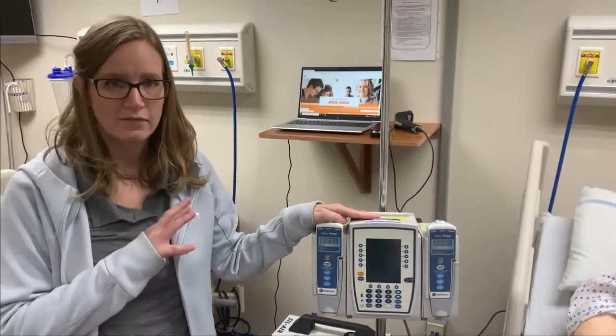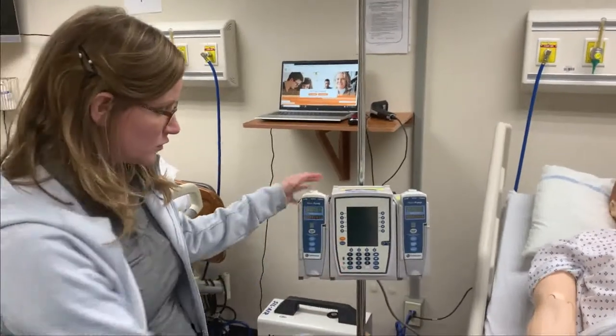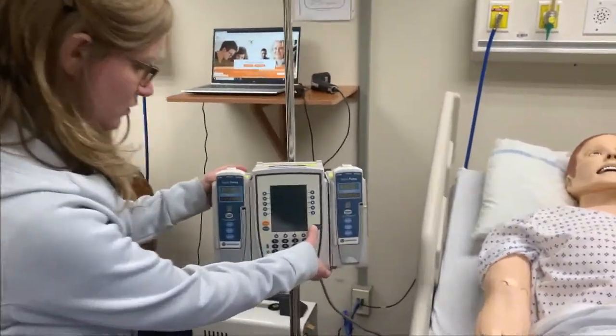This video is going to help you have a better understanding of how to operate the Alaris pump. The first thing you need to do, of course, is turn it on — system on.